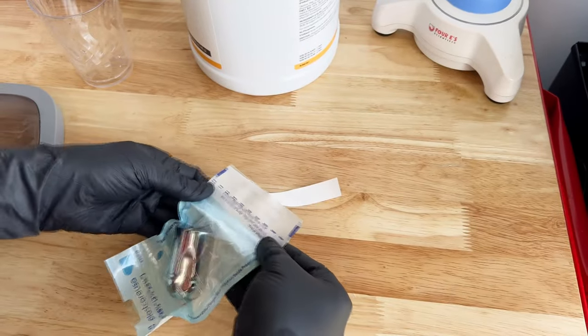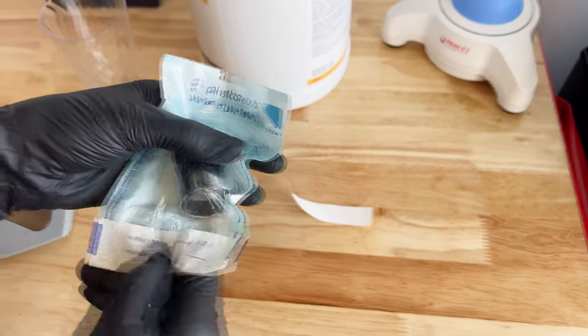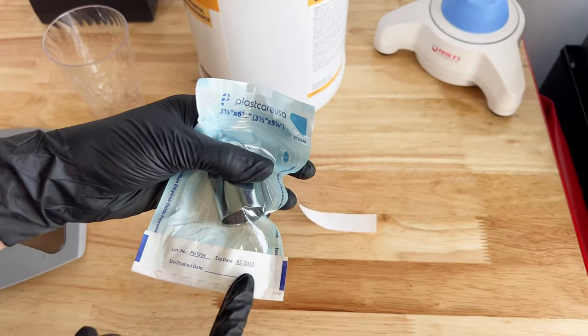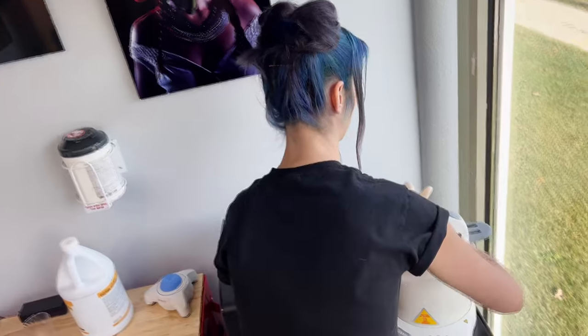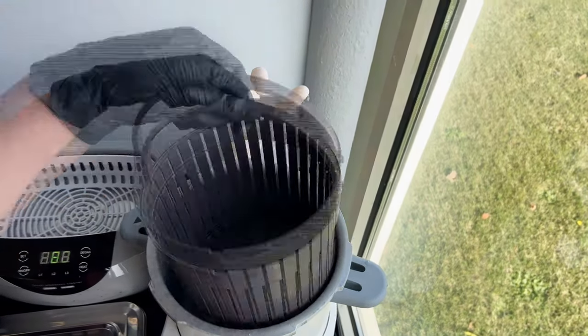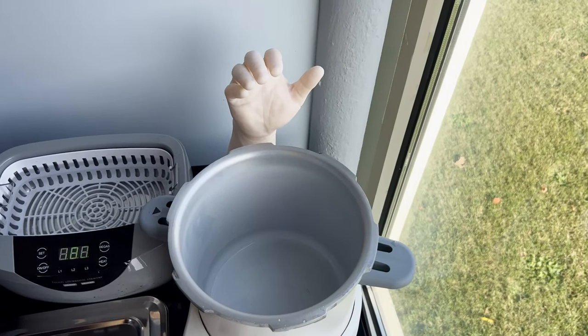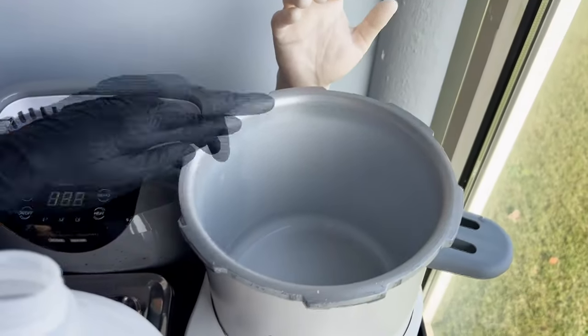We're going to seal the pouch. It has an expiration date for the pouch and an option to write in your sterilization date as well. Let's see what's going on inside my autoclave — it looks like it needs some water, it's empty. You want to make sure the water line is filled before you start. If you look closely you'll see the water line.